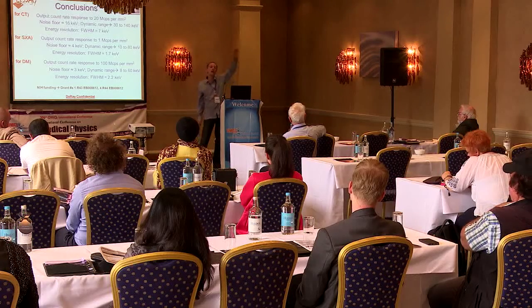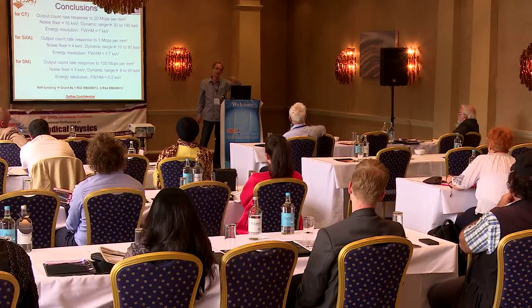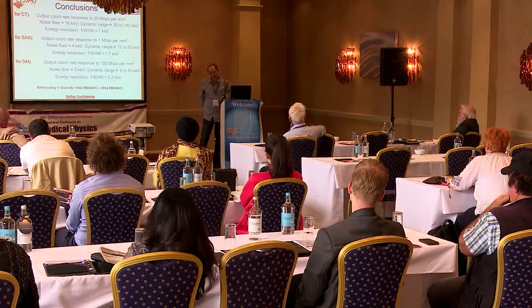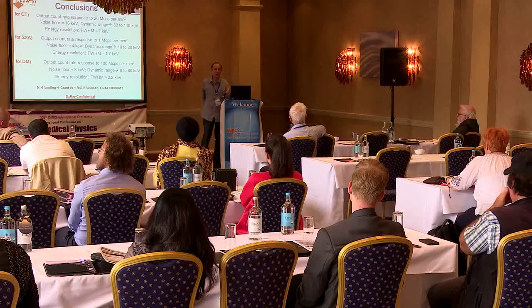At higher energy, there's a slightly larger dead time than there is at the lower energies. But as long as the peaking time is fast enough, it won't depend on the rate, so it will depend on the energy of the X-ray rather than on the rate.